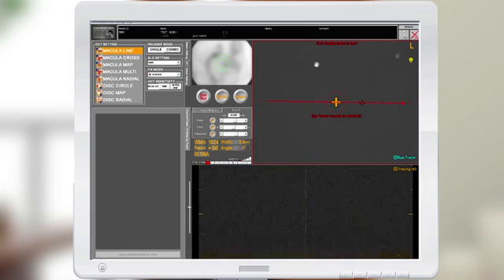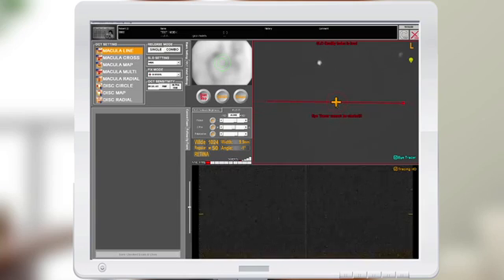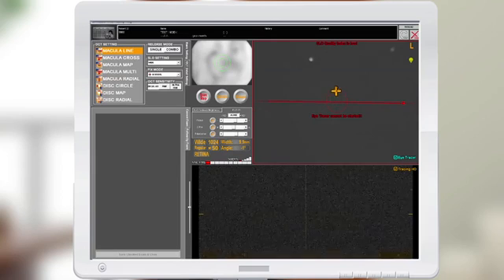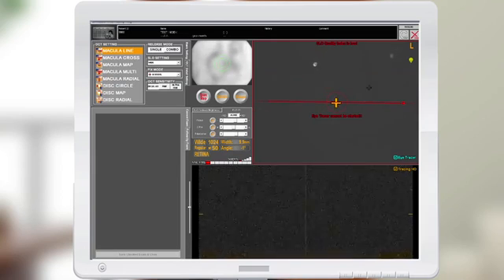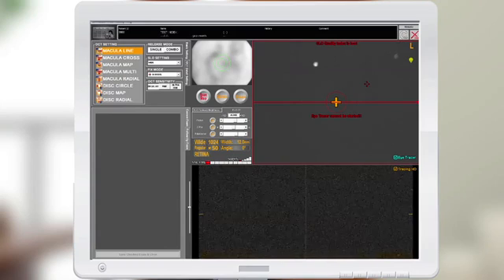You can also rotate the line scan with your rotation marker to any degree you choose, or move the line scan to an area of concern on the retina. There's a fixation that you can also adjust by putting your mouse on the fixation. The C button will clear the scan back to its original default setting.